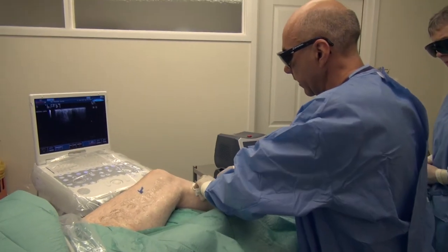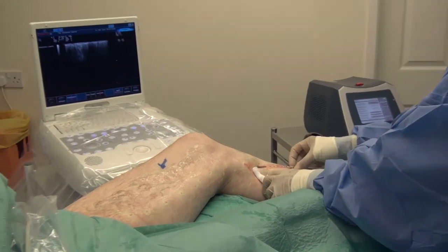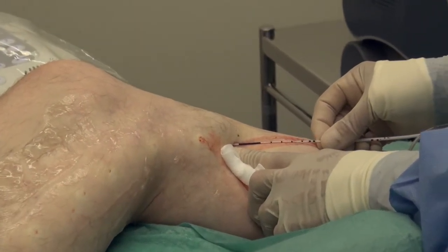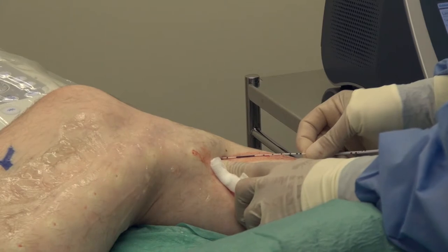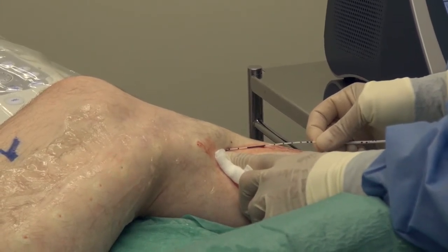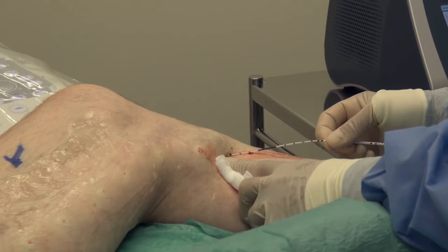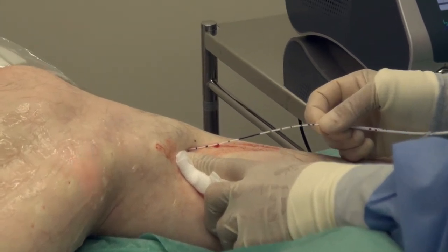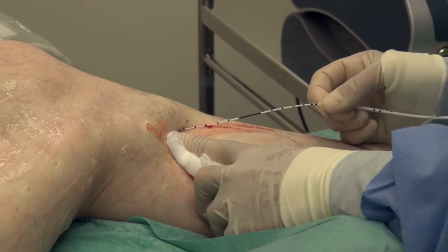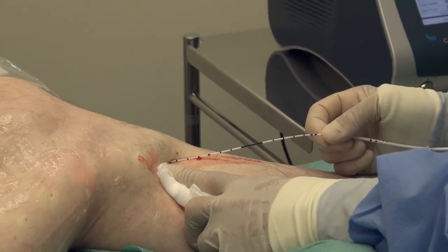Having reached a certain point, I need to withdraw the catheter introducer and continue the laser to the final portion of the vein, gently withdrawing the laser fibre at a rate that is in keeping with the metronome auditory signal in the background. Jane will disable the laser equipment before I finally withdraw the laser fibre from the leg, to confirm that there's no possibility of the laser being activated outside the patient's vein.